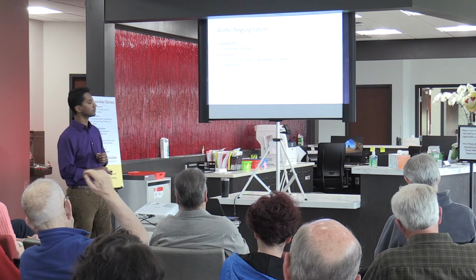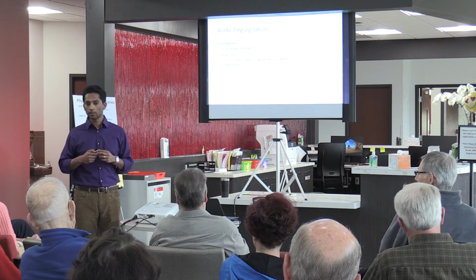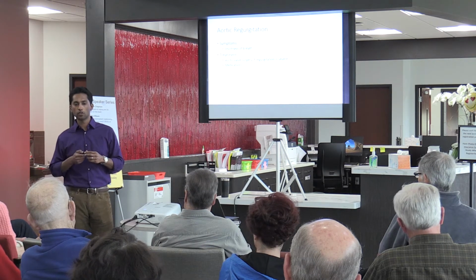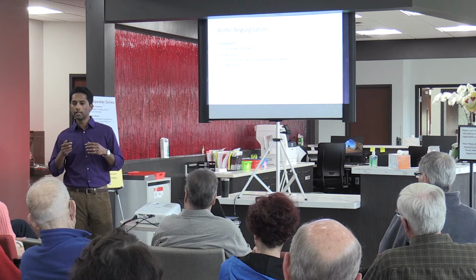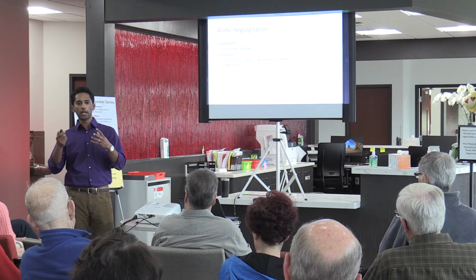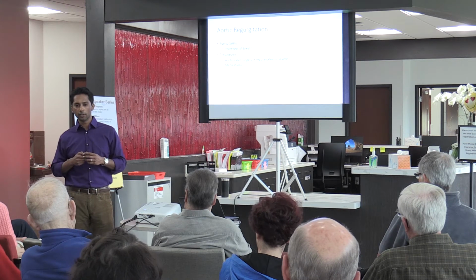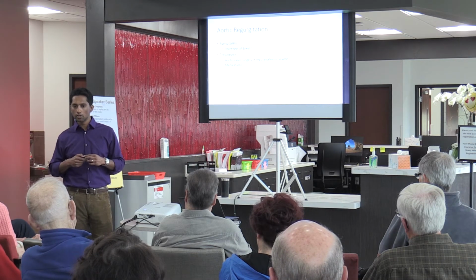Do you use animal valves for aortics? For aortic regurgitation? Yes. The question was, do they use animal valves for fixing this problem? And the answer is yes, right? They have two flavors of valves. They have mechanical valves, which are fully metal, and they have what they call bioprosthetic valves, which are part metal and part some kind of animal tissue. Typically that animal tissue comes from cows or pigs. You guys probably know some people that have either a cow valve or a pig valve, but those are the two most common flavors of animal tissue that's used.